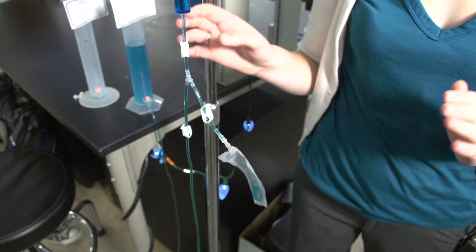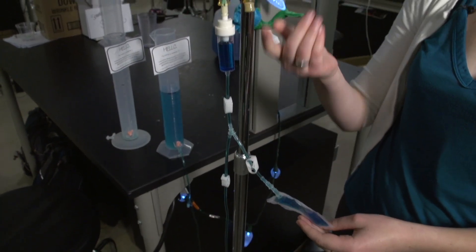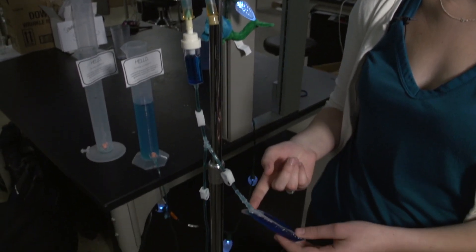We start with all the clamps closed. To fill the flush chamber, we open the top clamp and the clamp leading to the flush chamber. By gravity, fluid will move from the saline bag attached to the patient down into the flush chamber and fill it. This actually takes less time to perform than manually filling a syringe would.